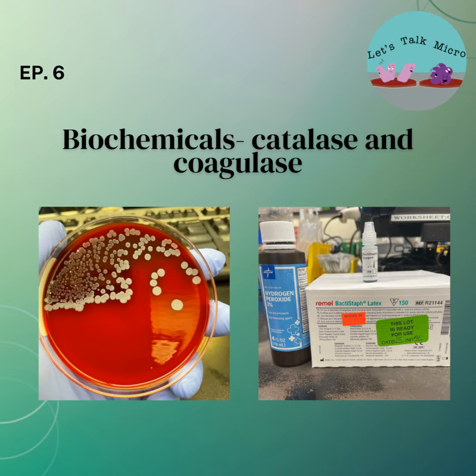So most labs use commercial kits. Very simple. The one that I'm very familiar with is the Bacti Staph Kit, which is made by Remel, no relation to the podcast. You have a card with some circles. You add a drop of your reagent, you mix it with a colony, and agglutination, or clumping, is observed.